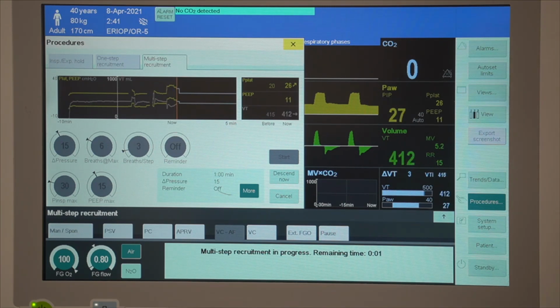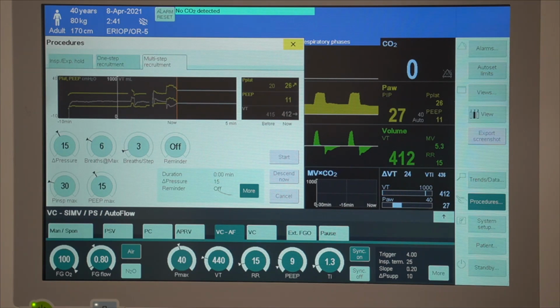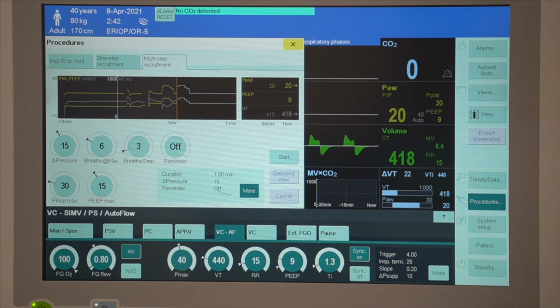Another way to have a good look at the best lung recruitment ventilation for the patient is to use the analysis tool on the Infinity acute care monitoring. John will show you a picture of this as well. Ultimately, to determine the best settings for a complicated patient would be to use the Pulmovista in the OR. We will look at this later in the webinar.